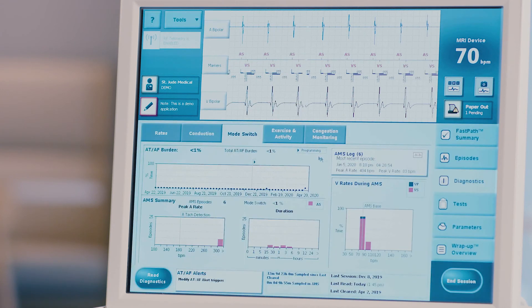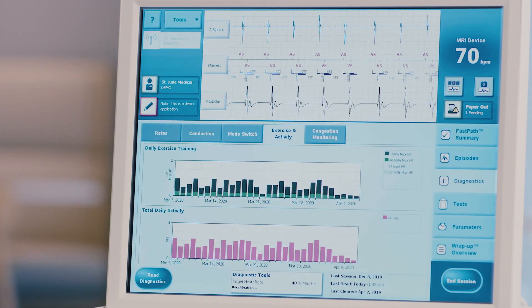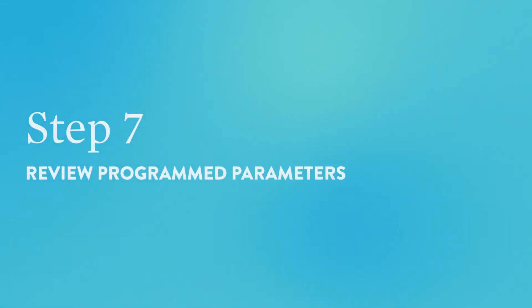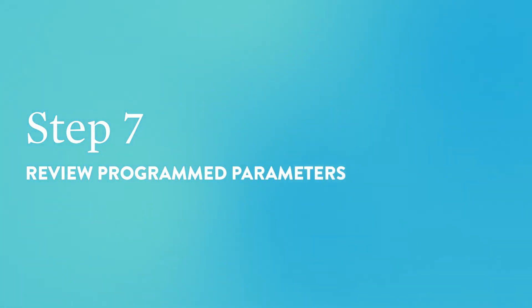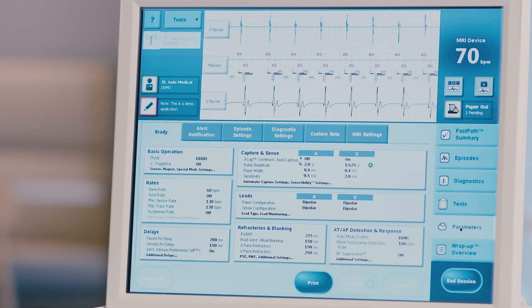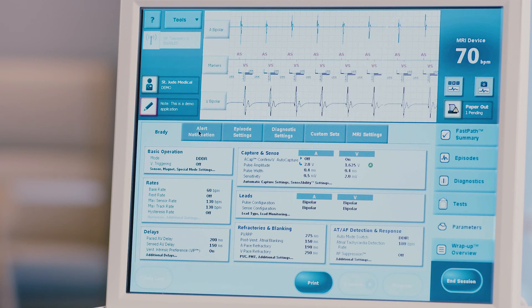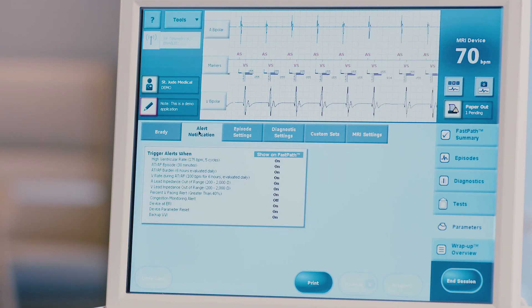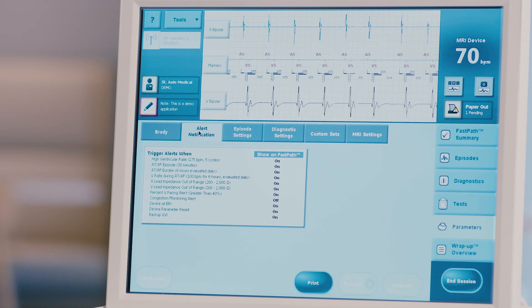Press the exercise activity tab at the top of the screen. Evaluate the patient's activity levels if necessary. Step 7: Review programmed parameters. Press the parameters tab on the right hand side of the screen. The Brady tab will appear first. All pacing parameters can be viewed or changed through this screen. Press the alert notification tab at the top of the screen. Here you can review the program settings for the FastPath summary alerts and patient notification alerts.